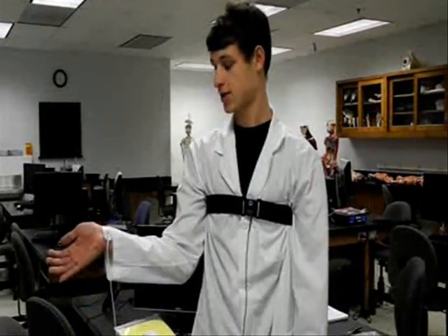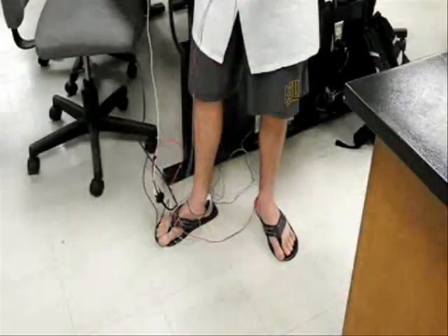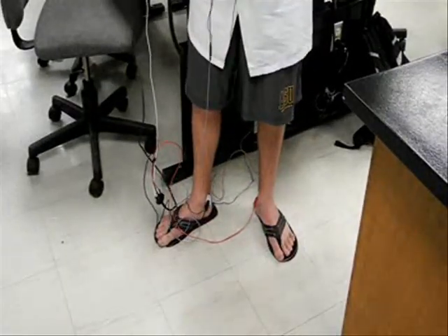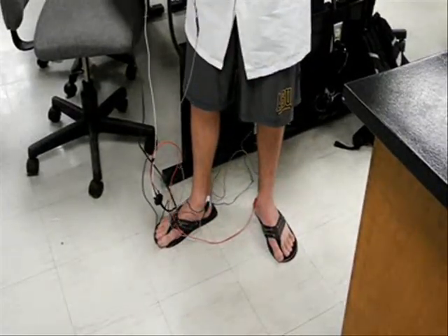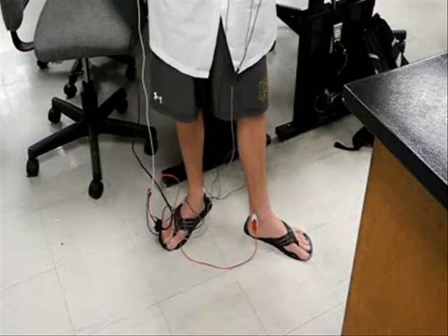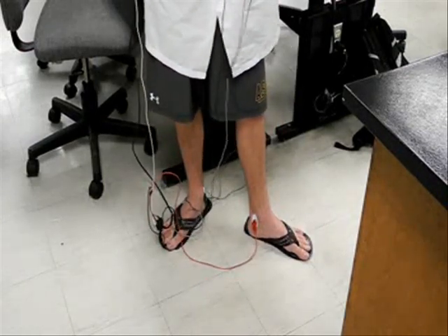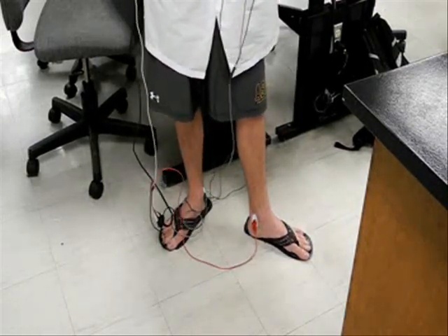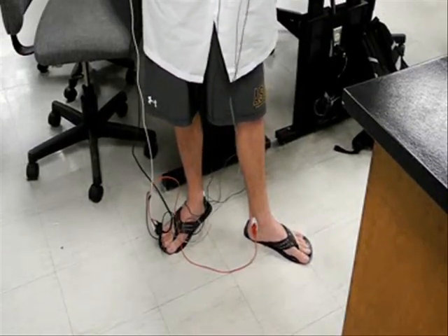The second thing we're going to connect is the set of three electrodes. This is going to go into channel two. The first electrode is going to be connected on your right wrist and it's going to be the white lead. The second electrode is going to be connected on your right ankle and it's going to be the black lead. And the third electrode is going to be connected to your left ankle and it's going to be the red lead.